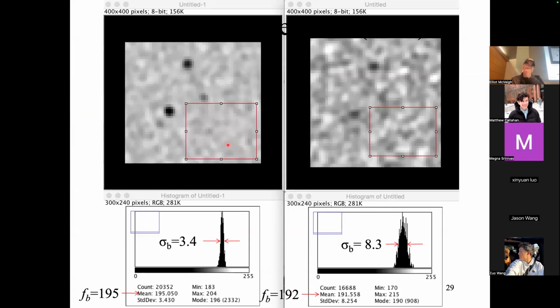And if we have a simple image that just has a little circular hole drilled in plastic, the plastic is in the background, and this should all be the same number, right? Because it all has the same material properties. There's a hole here, so it's air, so it should have basically the number minus 1,000 in a CT scan. You can clearly visualize that with this signal to noise. It's a little bit harder to visualize over here when our signal to noise gets lower, i.e. the noise is expanded.